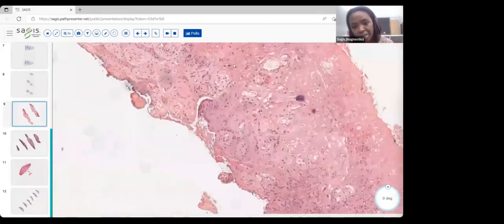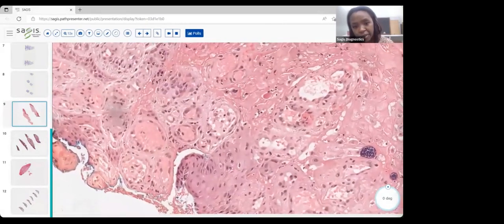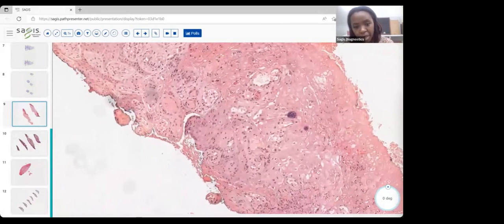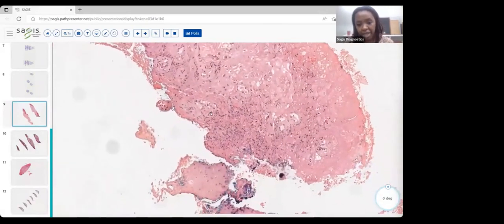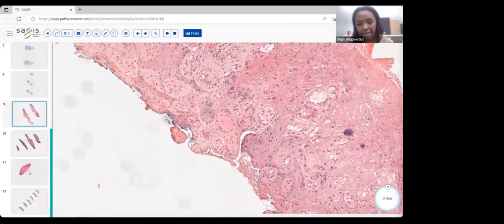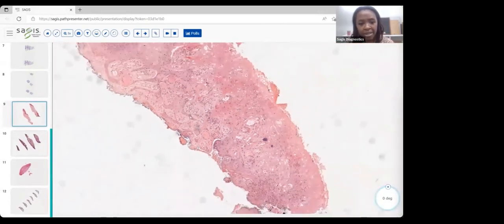You can also have multinucleation. Okay, so you have some cells that we're seeing that have more than one nucleus. Okay, so multinucleation. So we're definitely thinking about cytopathic effect and that there could certainly be a virus at play here. And then as we're looking at the epidermis and how it's breaking down, you know, there is a bit of a pattern to it. Let's take a look at this area, for example.